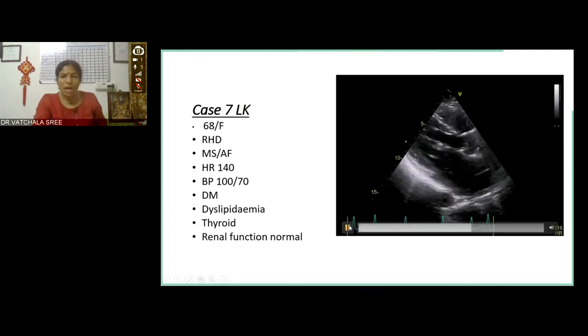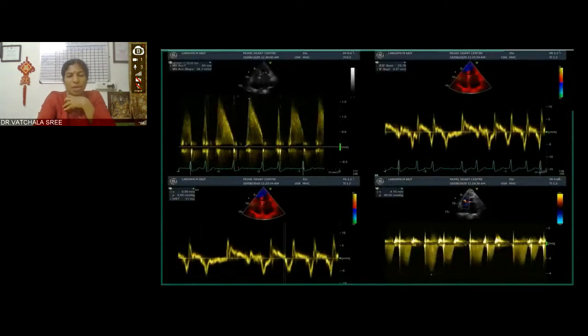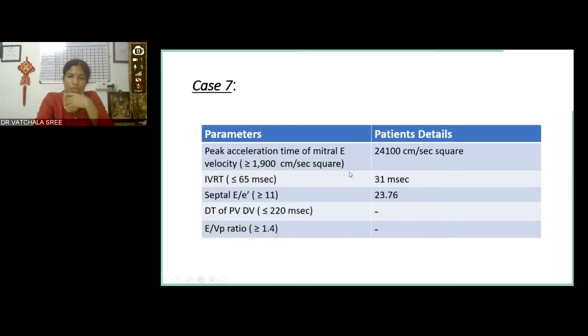Okay. So what happens is we already established that in mitral valve problems, and when you have atrial fibrillation, the mitral inflow pattern is not the right way to assess your diastolic dysfunction. All these people are going to have dilated LA, so the LA index volume is not good enough. All these people are going to have tricuspid regurgitation, so the TR is not good enough. So we need other parameters to say whether this patient is having diastolic dysfunction or not. And those parameters, we don't do it routinely, but actually it's not that difficult.